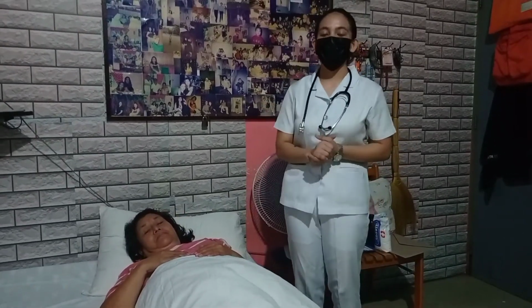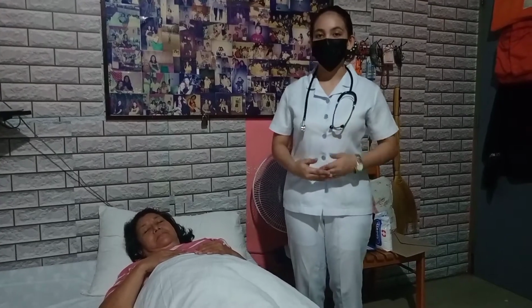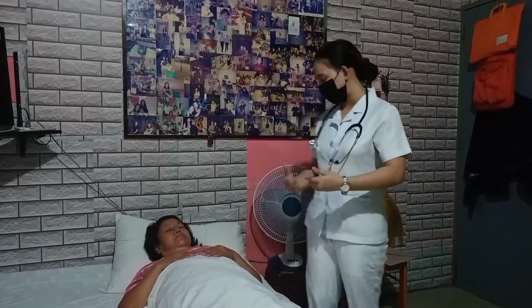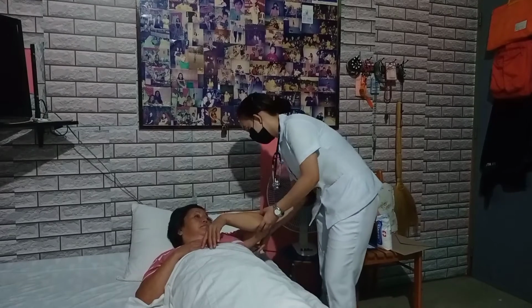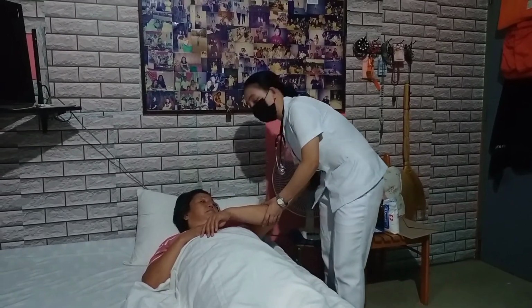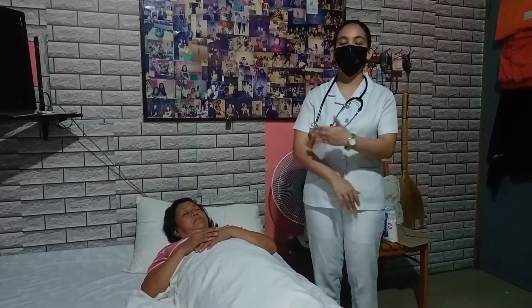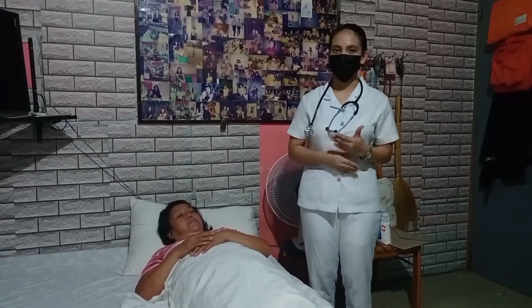Rationale: checking before doing the assessment is very important to ensure that your patient is safe. Palpate the site where you're going to inject your patient, which is the subcutaneous area. Check for any tenderness. Since I didn't feel any tenderness in the subcutaneous part of my patient, the rationale for that is to make sure that the part where you're going to inject your patient is now ready for the subcutaneous injection.